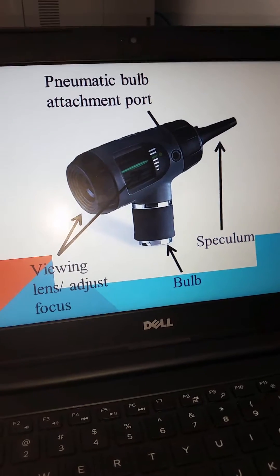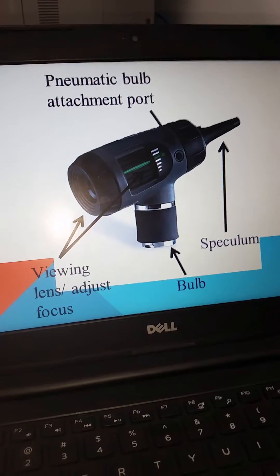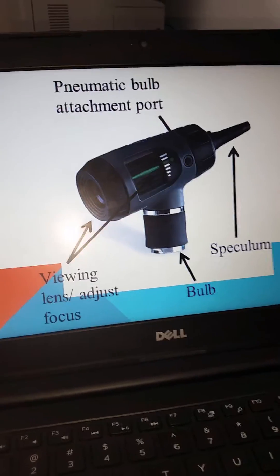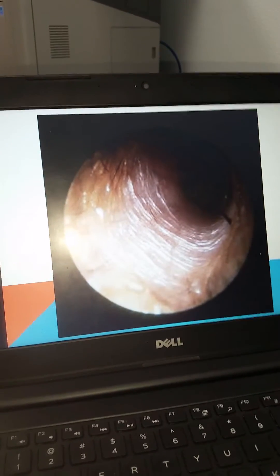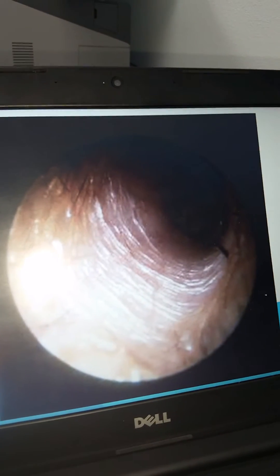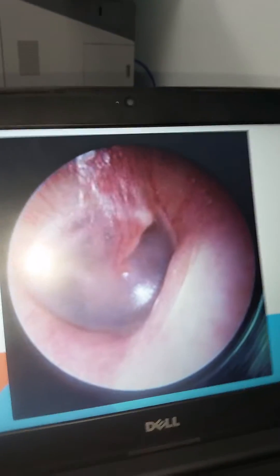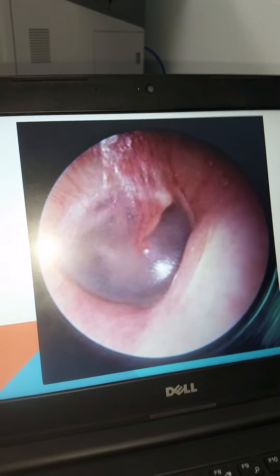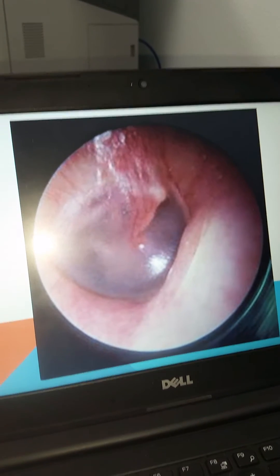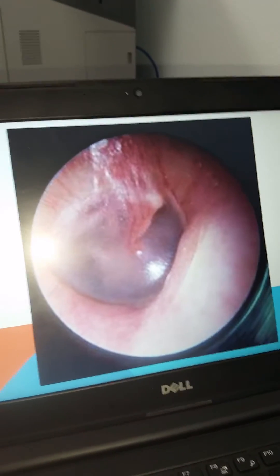This port would allow you, especially in pediatric patients, to do pneumatic testing of the tympanic membrane to check for otitis media and to see if there is tension on the tympanic membrane. When you are examining the external auditory canal, it should look something as such — notice that there is some dry skin within this external auditory canal, but eventually it will lead you to a normal examination of the tympanic membrane. Note that there is a slight injection at the handle of the malleus, but the cone of light and the other architecture is well visualized.